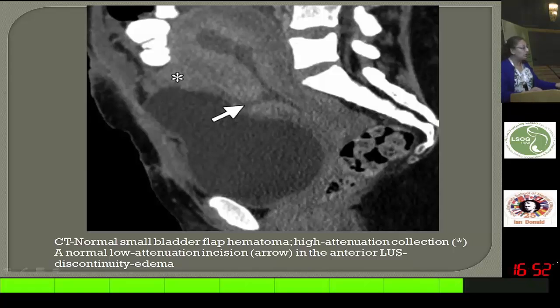It is not unusual. A hematoma which is around 4 centimeters in the postpartum period is acceptable. However, if it becomes bigger and associated with other symptoms and anemia, this is very significant. You can see the lining of the uterus and the area of the scar, which is also a normal finding.